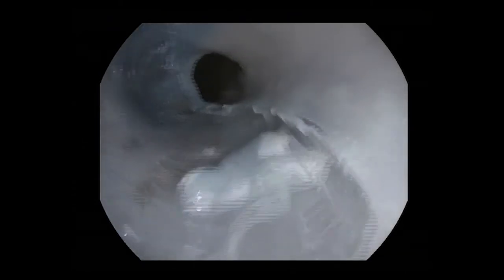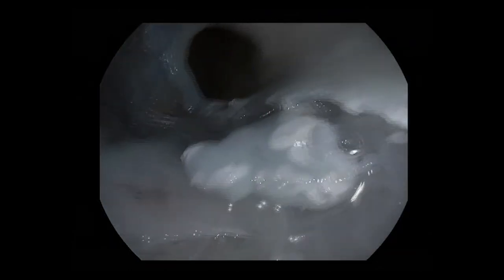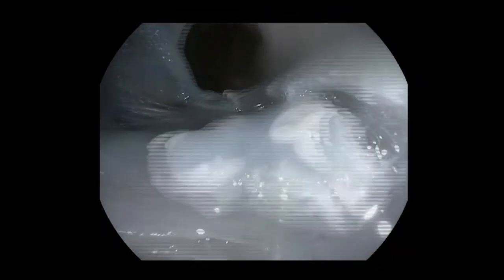Inspection of the ablation area shows that deep ablation has been achieved as far as the last third of the submucosa, above the muscularis layer in the esophagus.